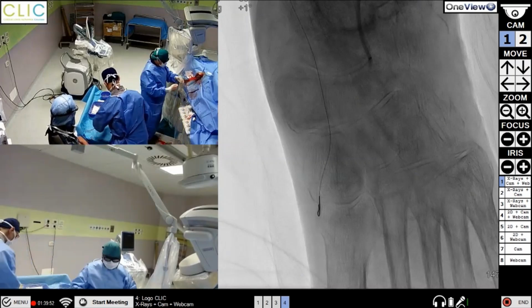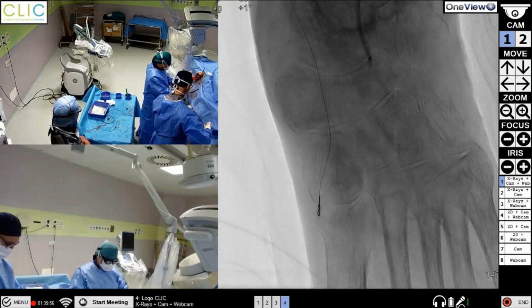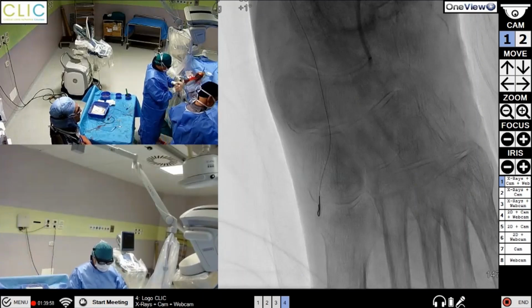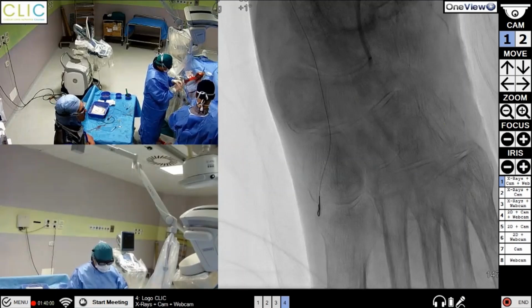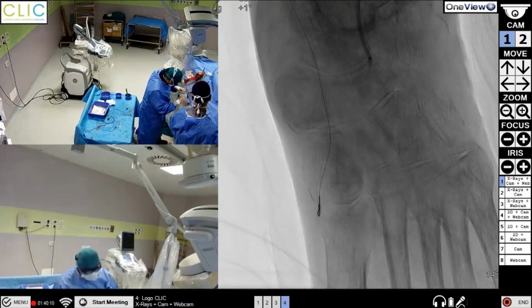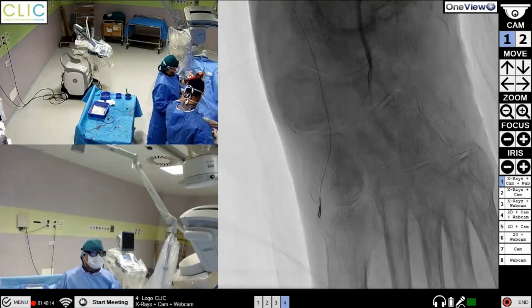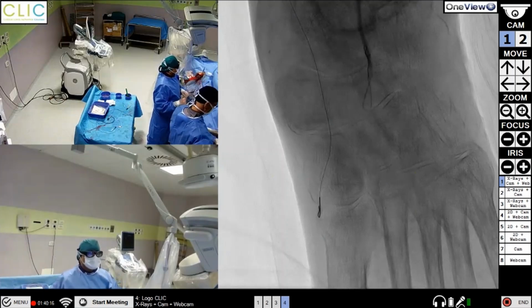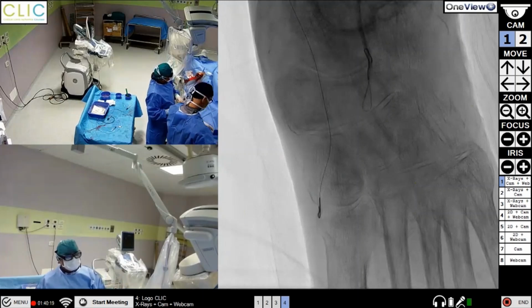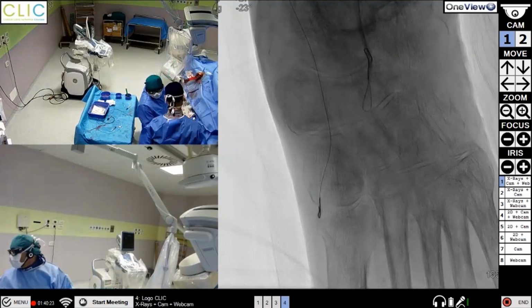If there is any question from the audience about the previous presentations as well as the live case, feel free. Yes, sir? From the microphone, please. Thank you. I'd like to ask you, sir, about the controversy of using drug-eluting balloons below the knee. At some time, there was fear of using them. What do you think about that?